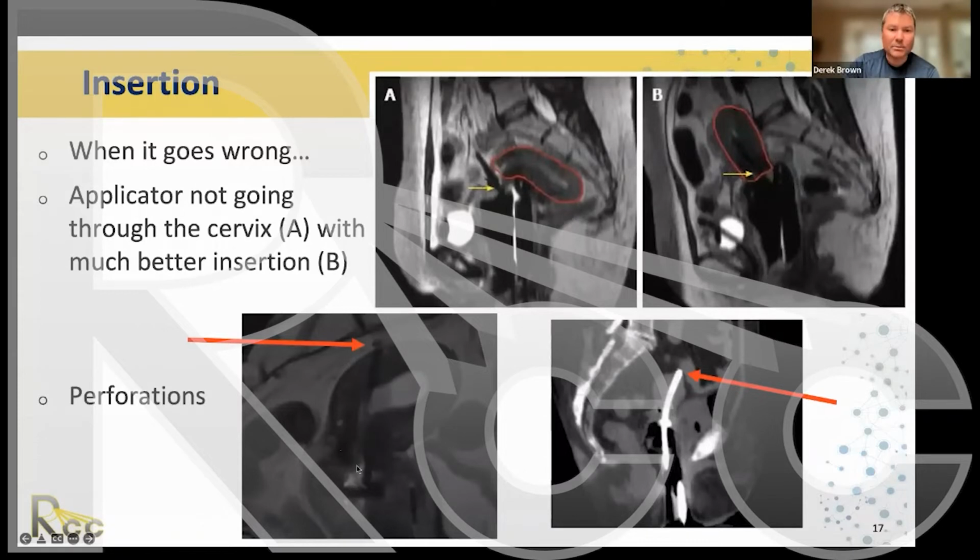Same in this case, a little bit more difficult because now you've created this channel here in the uterus and the uterine wall. So it's difficult to get past that. The tandem is going to want to keep going through that same channel. So in this case, you may just take everything out and have the patient come back at a later date when this has had time to heal, and you could try and get into that uterus.